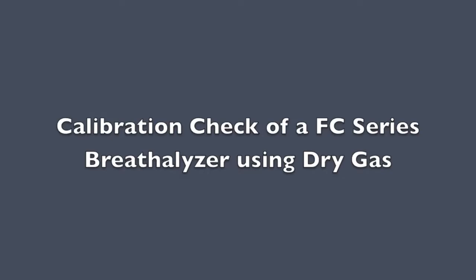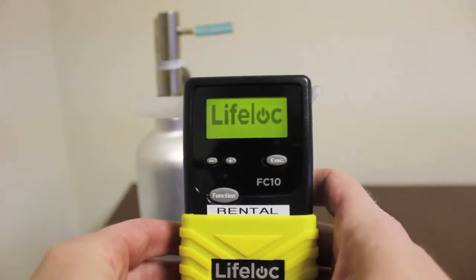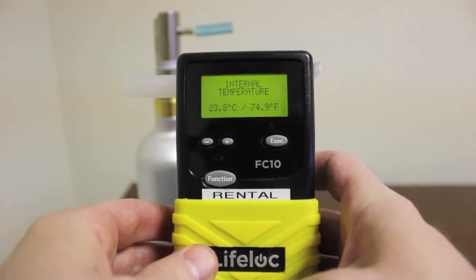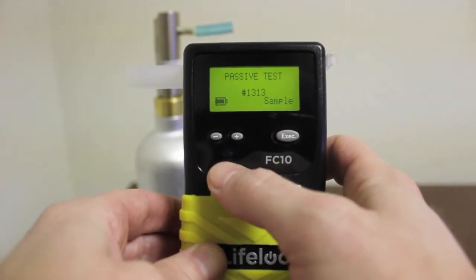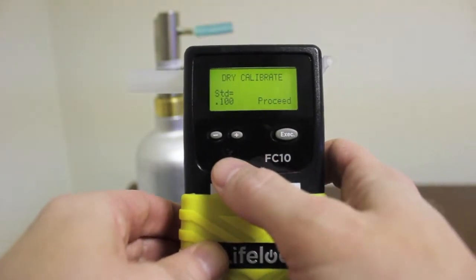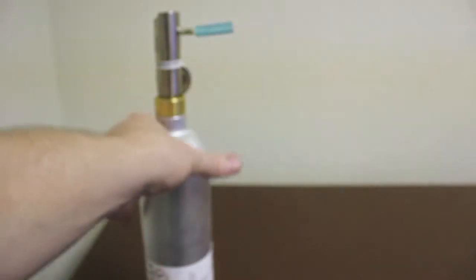Calibration check of an FC-series breathalyzer using dry gas. Turn the breathalyzer on. Press the function button until you reach the calibration screen and press the execute button. Press the function button until you reach the cal settings screen and press the execute button.